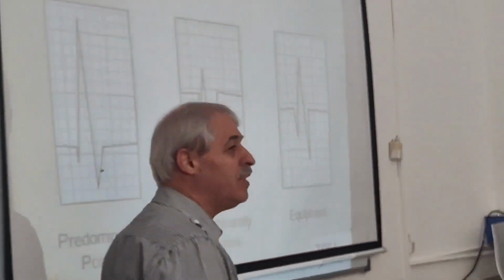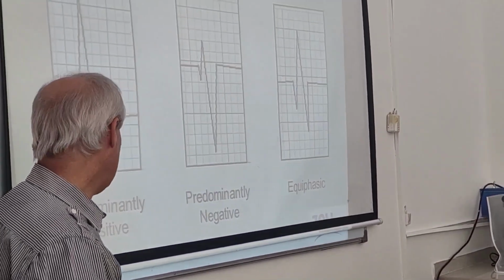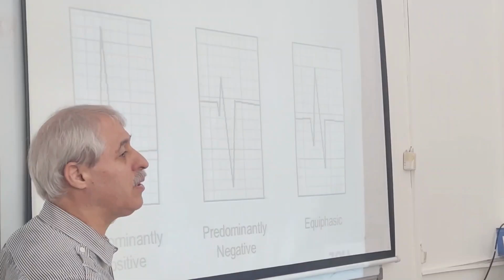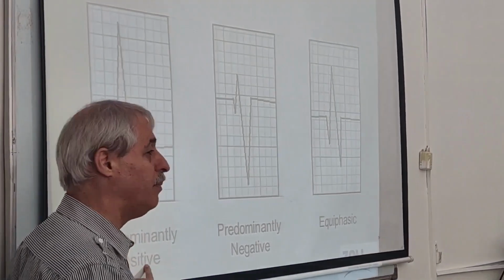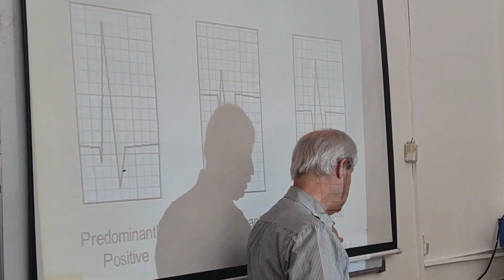Take a look at these three deflections. Here, the net deflection in this QRS complex is positive. Here, negative.